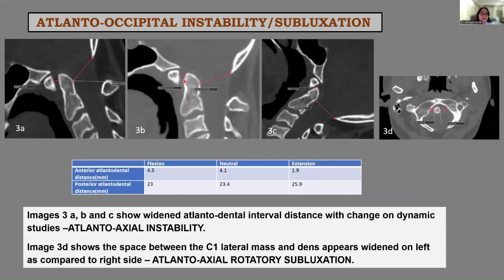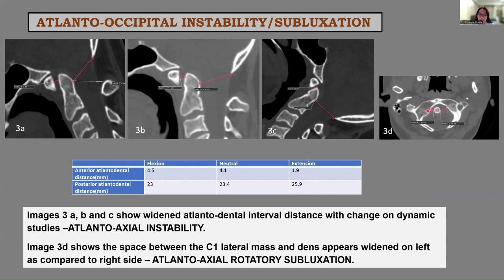In the same case, there is a widened atlanto-dental interval distance with change on dynamic studies — that is, on flexion and extension — suggestive of atlanto-axial instability. Image 3D shows increased space between the C1 lateral mass and dens on the left side compared to the right side, suggestive of atlanto-axial rotatory subluxation.